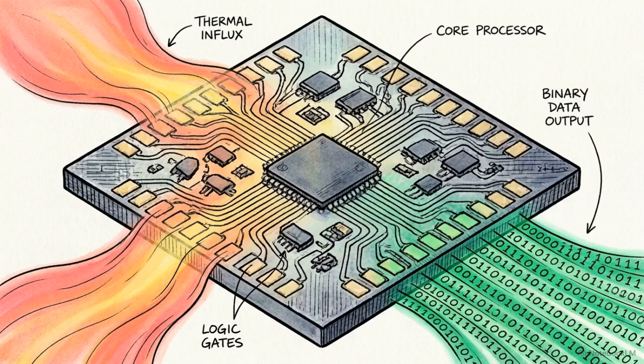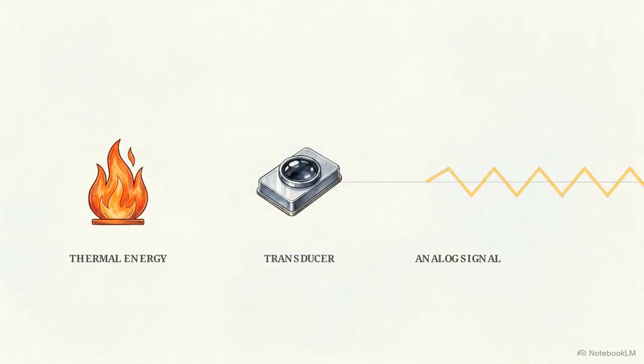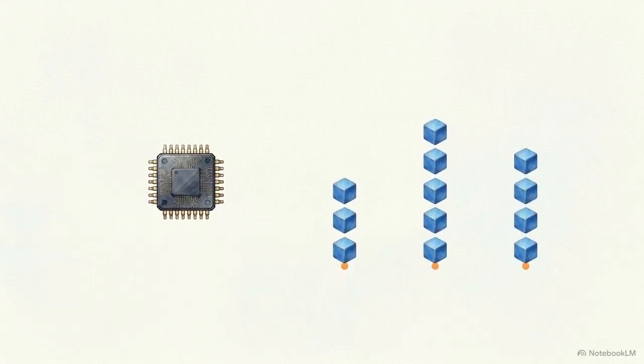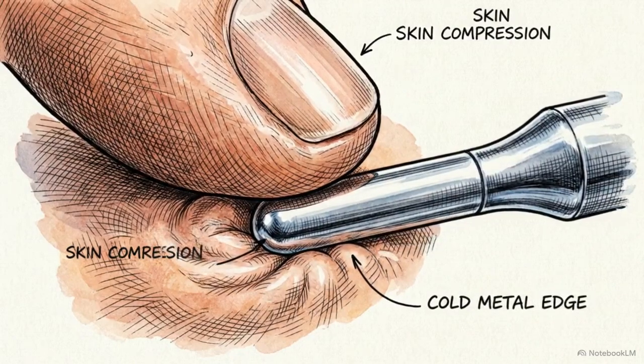Instead of sensing temperature directly, the device operates strictly as an interpreter, rapidly processing a chain reaction of physical and electrical forces. That familiar beep signaling a completed reading is the final step of a microscopic relay race, converting physical reality into actionable data. The process begins at the exact point of macroscopic contact.